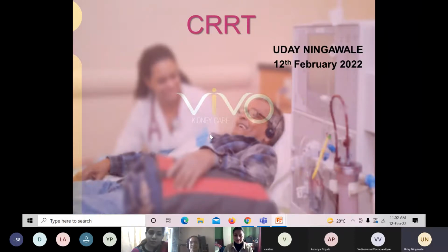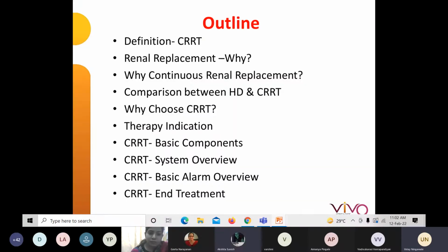Today our topic is going to discuss CRRT. So the outline of my topic: what is the meaning of CRRT? Then why is renal replacement needed in healthcare? Why does continuous renal replacement have to be there, and what is the comparison between regular hemodialysis and CRRT? Why choose CRRT? Because there are certain criteria for choosing CRRT. If the patient can tolerate hemodialysis very well, then there is no need of CRRT.